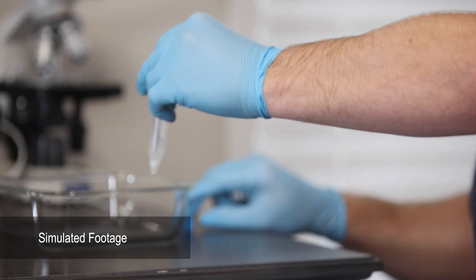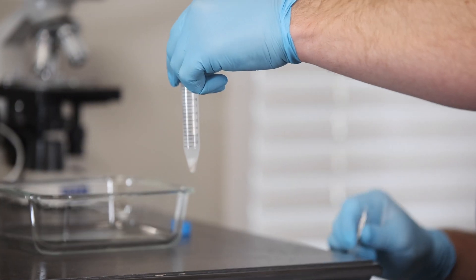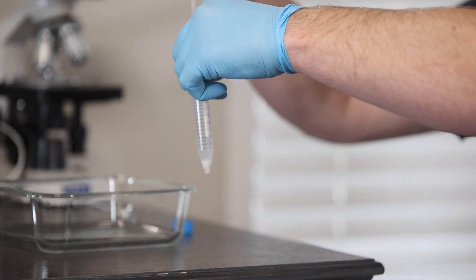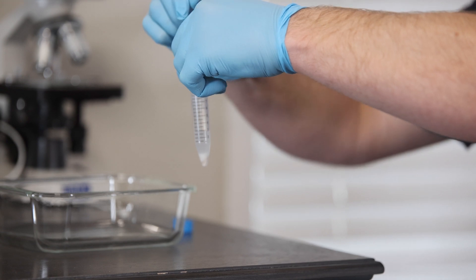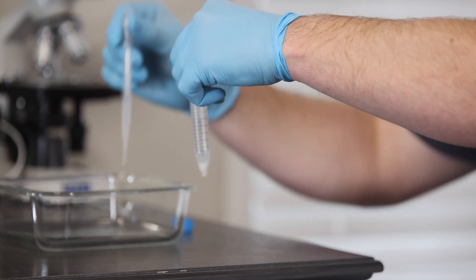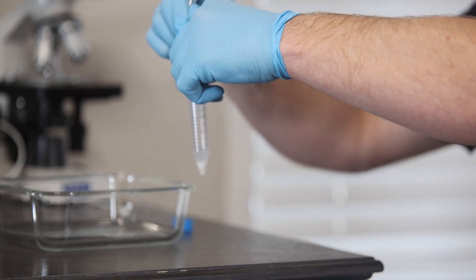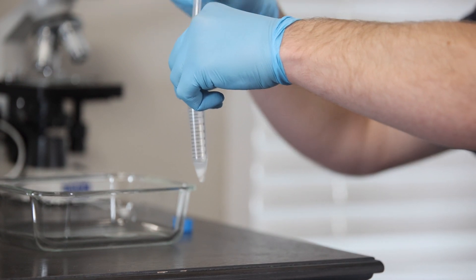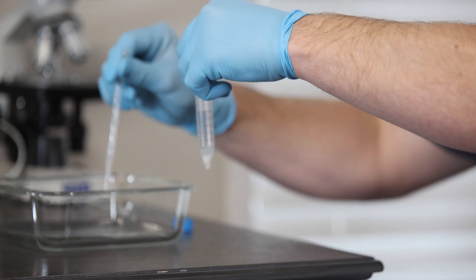You'll want to carefully unscrew the cap and place it on a rack or have it steady to perform your extraction of the seminal fluid. Using a sterile pipette, remove as much of the seminal fluid as possible without disrupting the sperm concentration at the bottom of the centrifuge tube. This takes some practice and it's easy to panic and accidentally force fluid back into the tube and disrupt the sperm concentration.